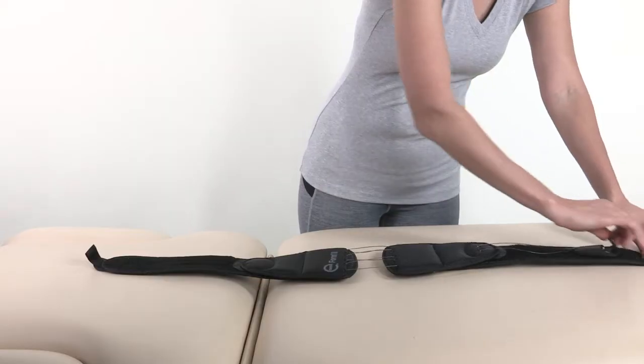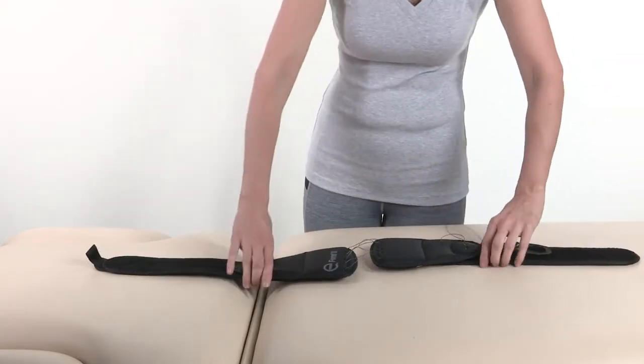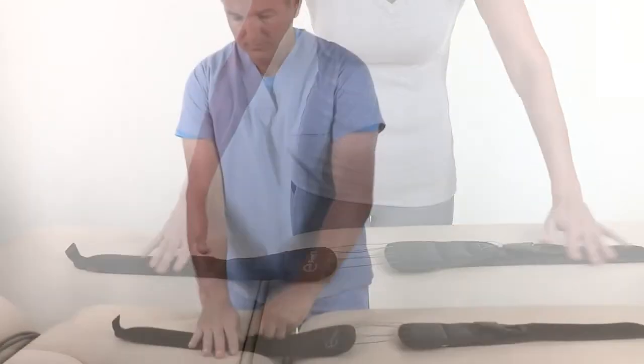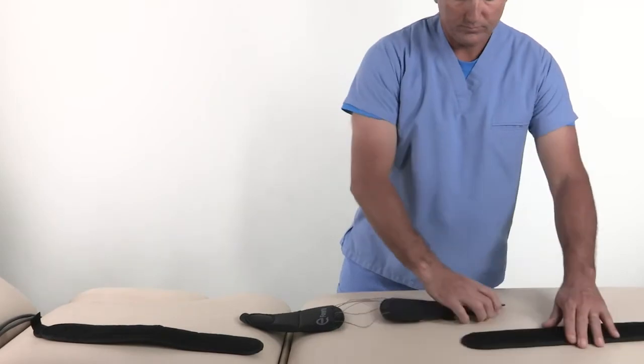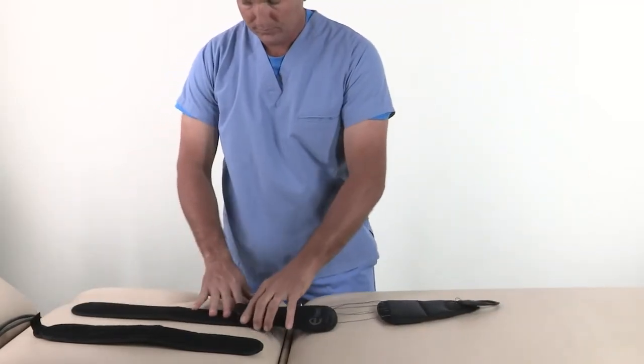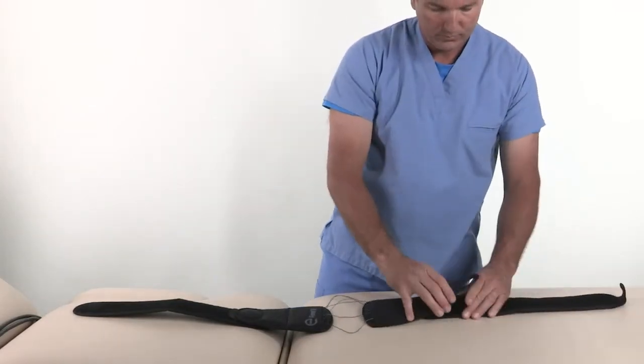Step 1: Open the brace. Detach the pull tab from the belt wings and pull the rear panel section in the opposite direction to open the brace. The pull tab may be oriented on either the right or left hand side of the patient; however, the belt wing with the hook should be secured on the opposite side of the pull tab.